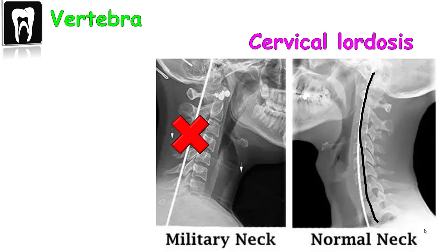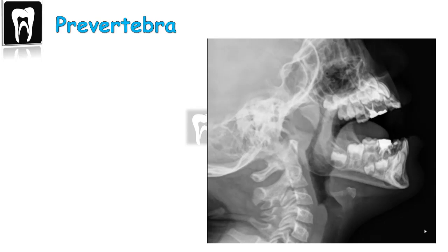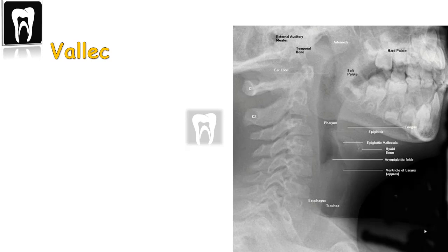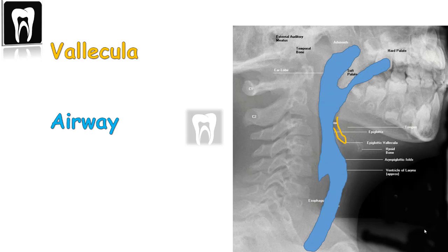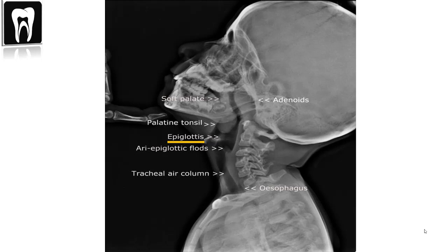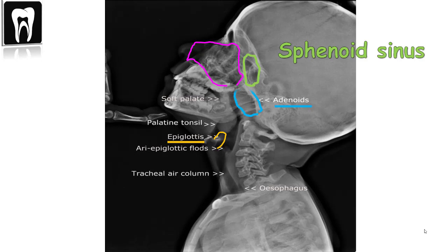The soft tissue in front of the vertebra is called the prevertebral shadow, and its size is very important. All the black area is the airway and around it is soft tissue. Here you can see the epiglottis, the nasal cavity, and in the skull base the sphenoid sinus. Any soft tissue hanging down underneath the sphenoid sinus is the adenoid.